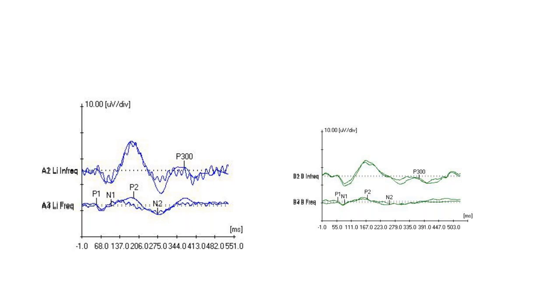Hello. We can hear you. Ma'am, I wanted to ask, when we are using correction for the ocular potentials in the second channel, is it possible then to use different acquisition parameters? Because I am guessing that the ocular potential may need a different filter setup and acquisition parameters than the CAEPs, or how is it? You can change it and do it, but otherwise you can do with the same. Again, it depends on the instrument. If the instrument doesn't have the facility to vary it, you can do it with the same. But it is preferable that you change it independently. Okay, thank you, ma'am.